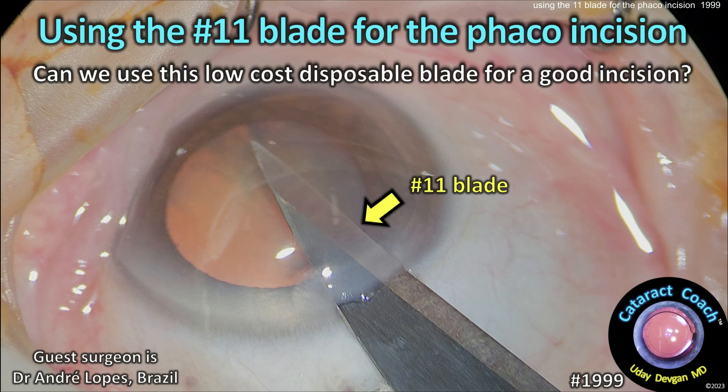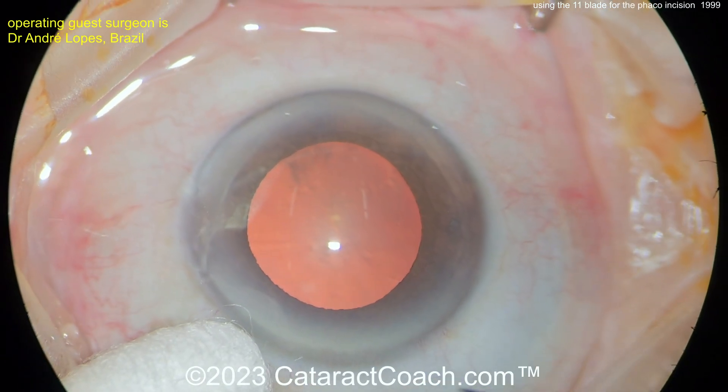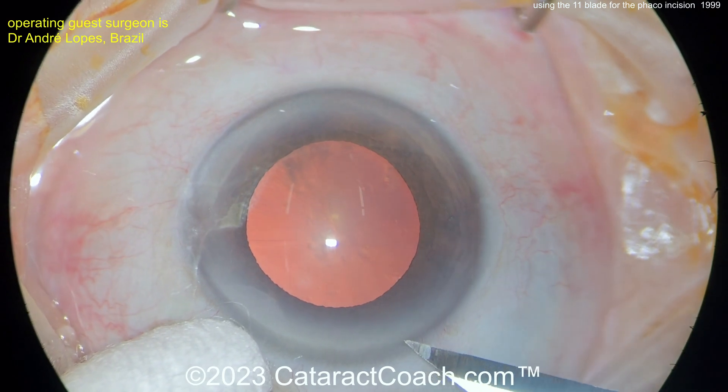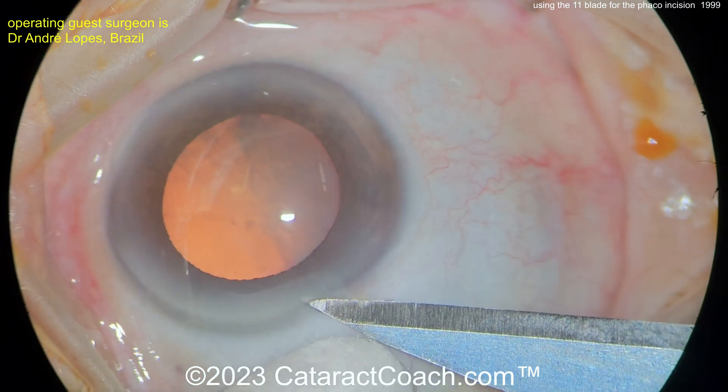cataractcoach.com — using the 11 blade for the phaco incision. Can you use this low-cost disposable blade for a good incision? Watch this. This is a very inexpensive blade; it's not designed to make a corneal incision, but you can do it. A surgeon here starting off, entering the eye.